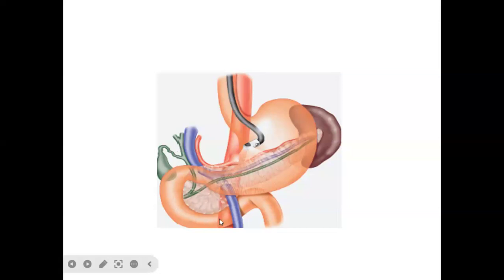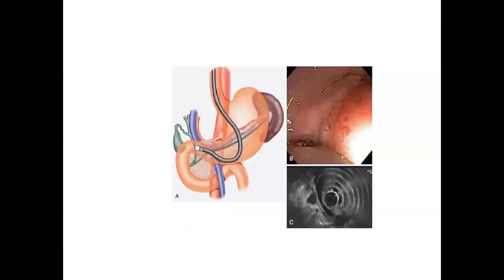Then the second part of the duodenum also gives you nice pictures, meaning that we are able to image the pancreas at different angles. This picture is just showing you how we are combining the 2 procedures, endoscopy and sonography. Then we get the pictures that we want. This is showing us the scope in the first part of the duodenum, which is station number 2.